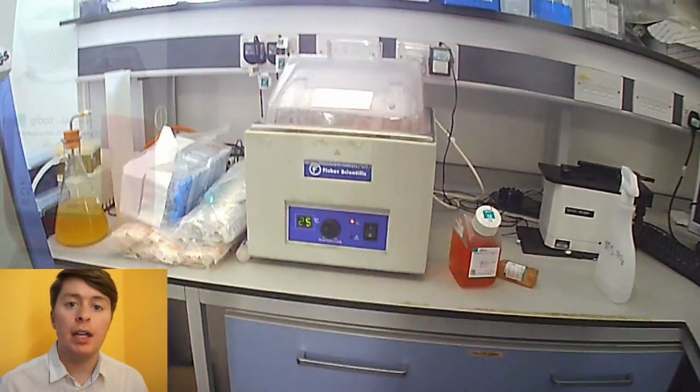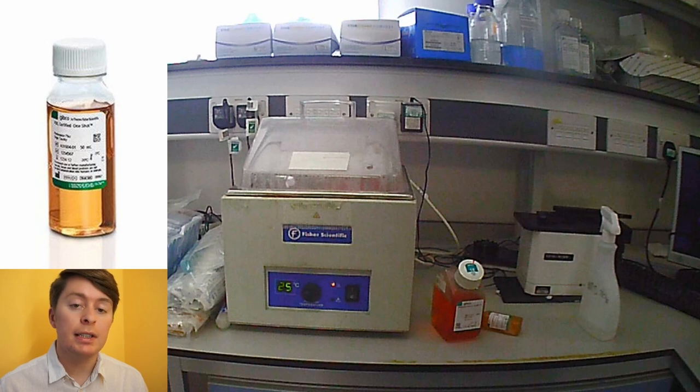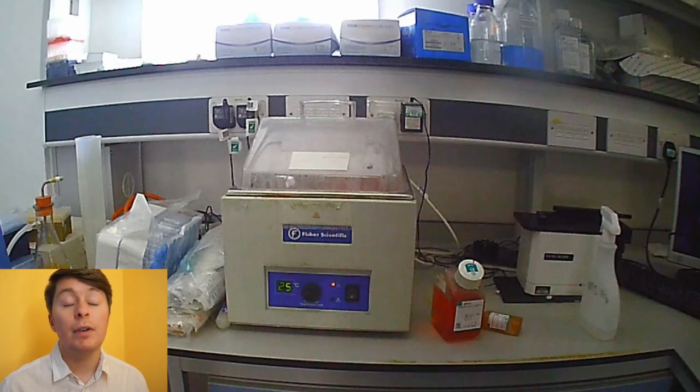So I started with RPMI 1640 Glutamax media, and I added 10% fetal bovine serum. I added 1% antibiotics, which were streptomycin and penicillin. Usually these things are frozen, especially if you're storing fetal bovine serum for a long time, you want to have it frozen. And generally when you order antibiotics, you can split them into smaller aliquots of the desired quantity. In this case, because we've got a media of 500 mils, we need 50 mils, which is the 10% of the fetal bovine serum, and then finally 5 mils of antibiotics so that we can make up a 555 mil stock of media to culture our Jurkat T-cells in.